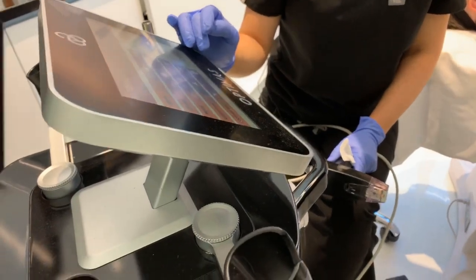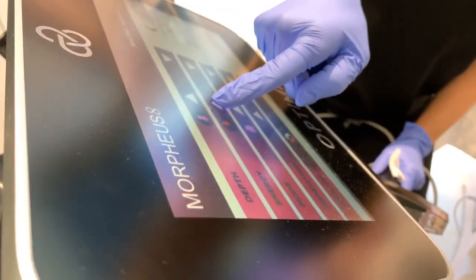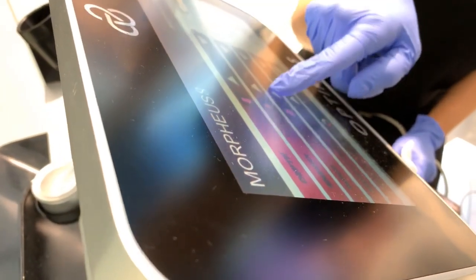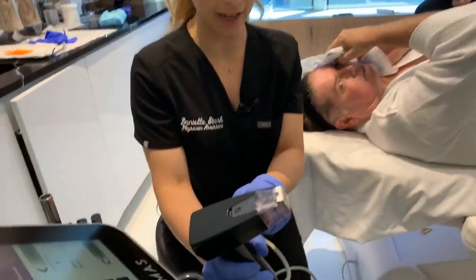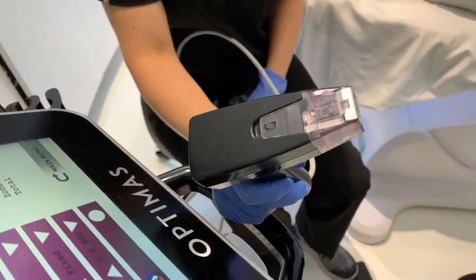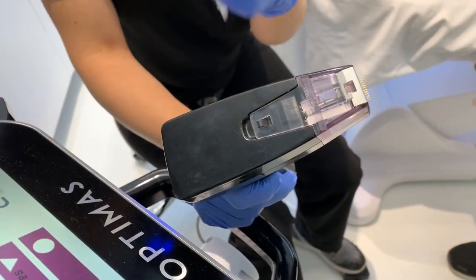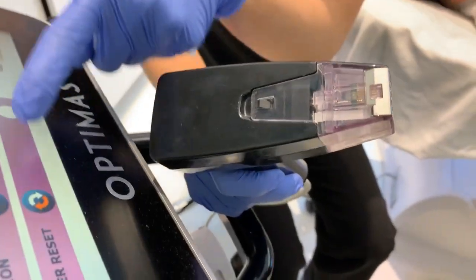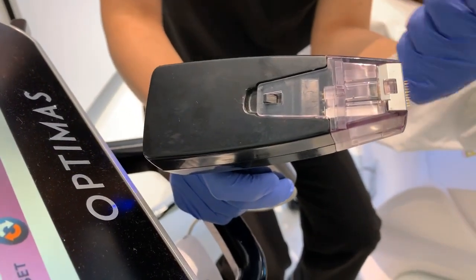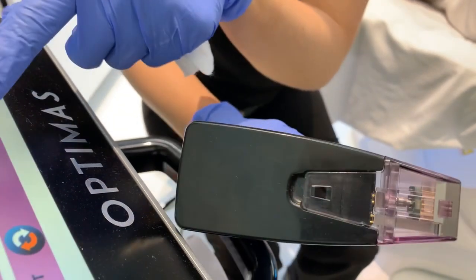So we're going to start on periorbital for the forehead. And for energy, we're going to crank this all the way up. We're going to do energy 30. Now, the other thing about the Morpheus treatment, this is the hand piece. What I want to show you is that you can have these needles fixed to where they stay out as they continue to deliver energy, or we can cycle it so that it gets automatically repeated. So that's another feature, and this is really great for consistency with your treatment.